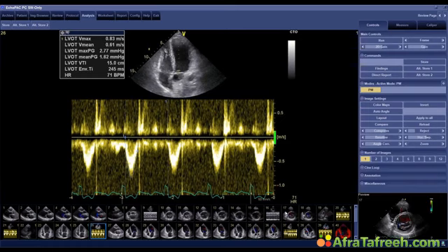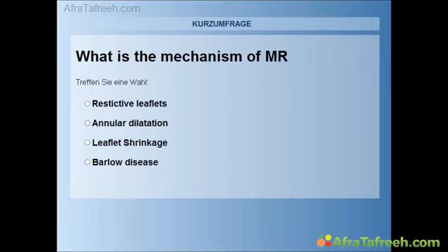But before I answer this question, let me go back to the slides and ask a question to you. Remember, we have the possibility of asking polls to you, and this is my first question. You'll be seeing it in a second. Okay, I hope you can all see the question.